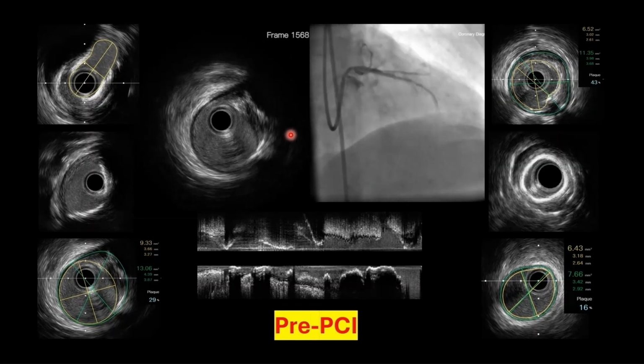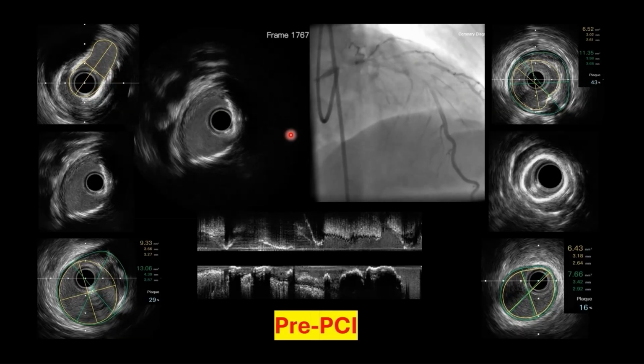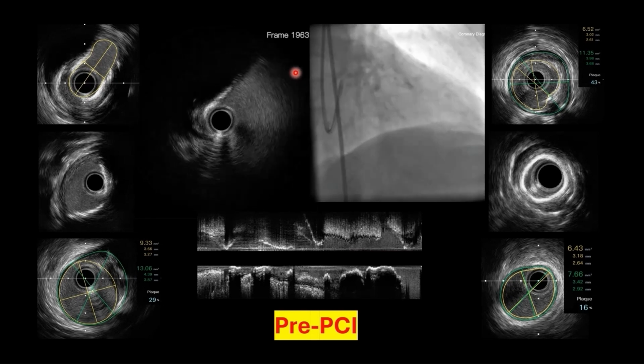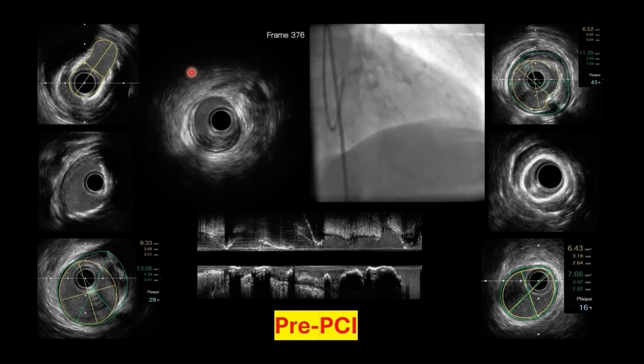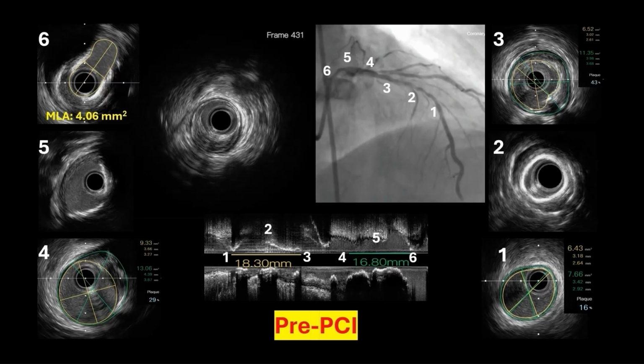Distribution is predominantly on one side of the vessel wall and the lumen area is not so bad. The pattern of calcium might be more challenging to modify with a device. Especially, the lesion of the left main ostium presents 2 large calcium sheets on the opposite side. It's about 150 degrees and there is still fibrotic tissue between the 2 calcium sheets.